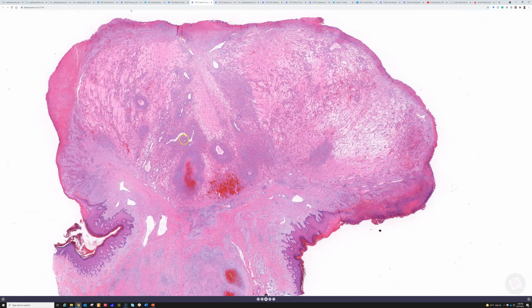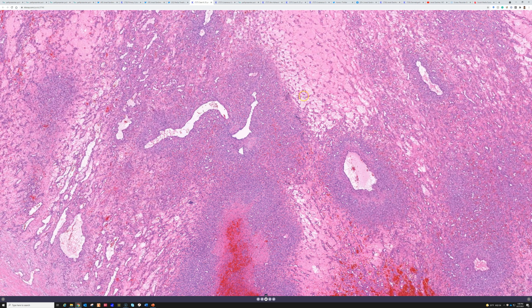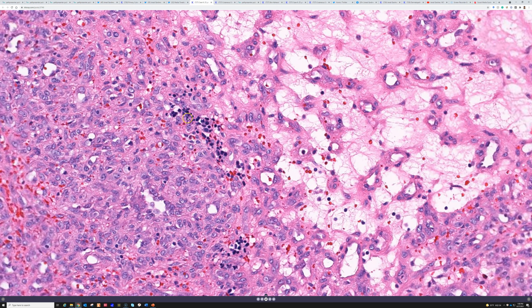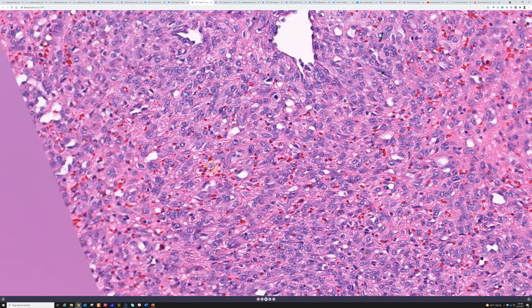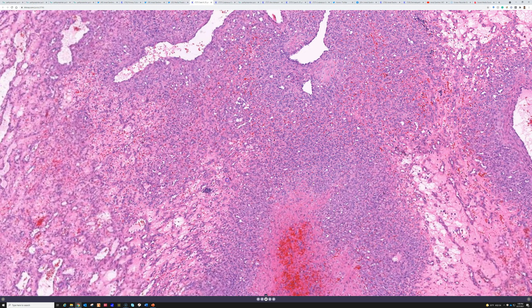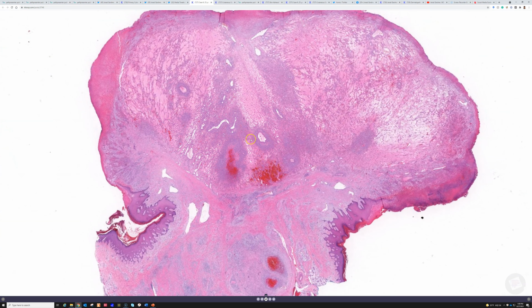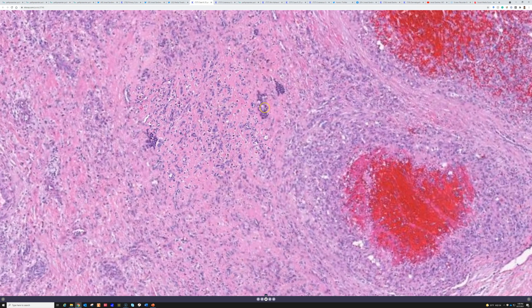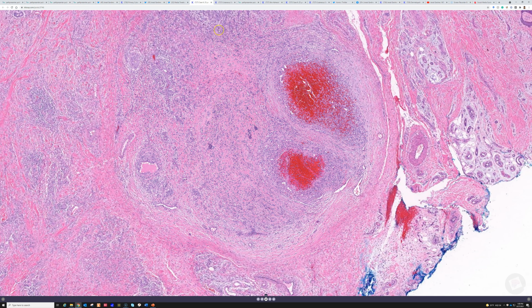And this is a massive pyogenic granuloma, lobular capillary hemangioma. And the bonus finding that's really fascinating is, look, little red and white cell precursors. So there's extramedullary hematopoiesis in this massive PG here. A curious incidental finding. There's some more of it down here, if I recall. Yeah, there it is. But we're not doing a dermpath or soft tissue lecture, so I guess I should move on.